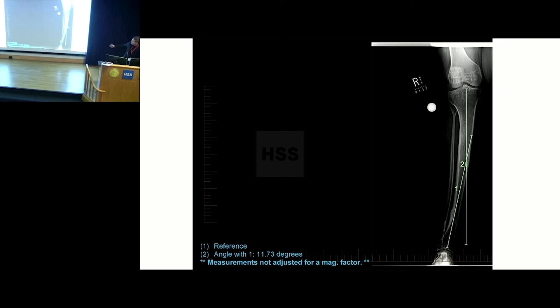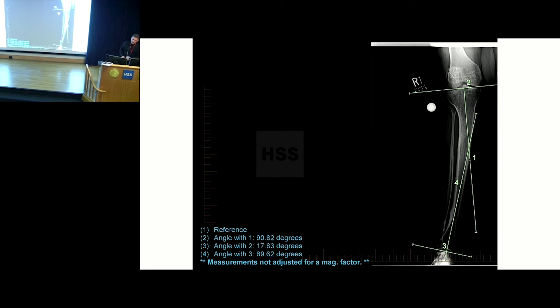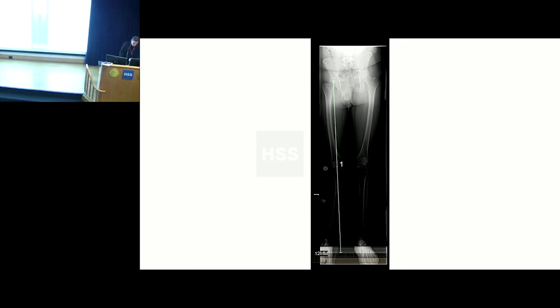This is just an anatomic axis line drawn down and up, creating an apex with a magnitude of 11.3 degrees. If you chose to measure the deformity with this method, that's what you get. Using a joint orientation angle subtended at 90 degrees gives a different magnitude: 16.76 degrees and a slightly different CORA. Using an LDTA and proximal joint orientation angle gives yet another magnitude: 17.83 degrees and a slightly different CORA.